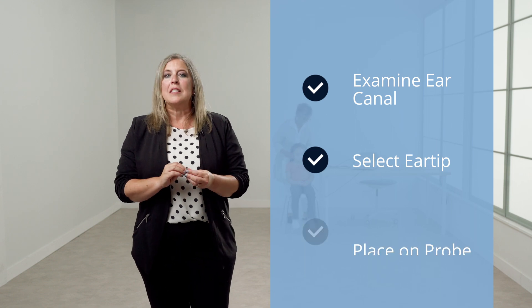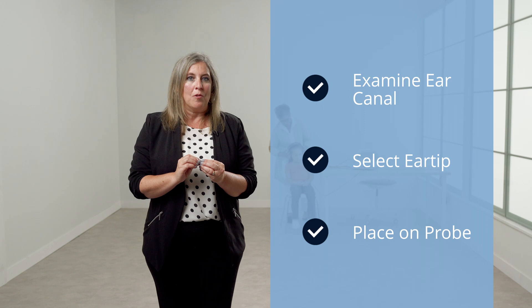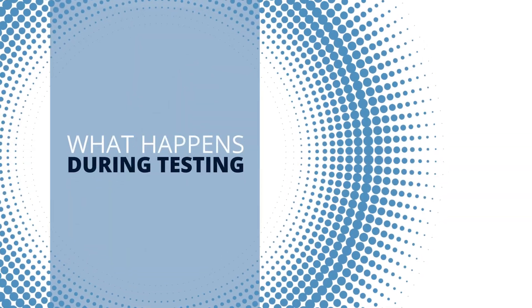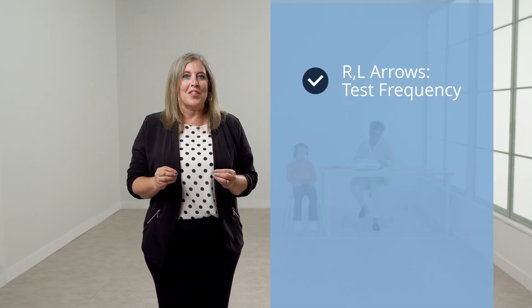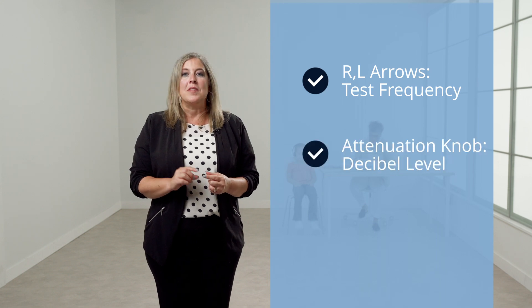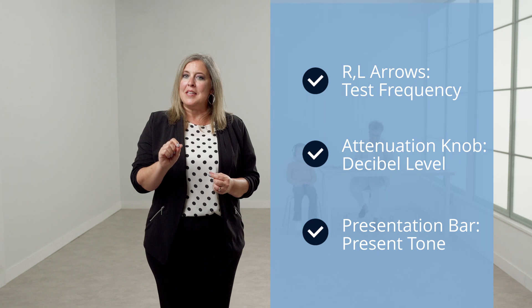For insert phones, examine the ear canal for obstruction or excessive cerumen. Place the tube of the foam ear tip completely onto the sound tube for each earphone. Roll the foam tip to the smallest diameter possible and insert the ear tip well into the ear canal, with the red earphone in the right ear and the blue in the left ear. Select the test frequency using the right and left arrow buttons. Select the decibel level with the attenuation knob. Present the tone by pressing the presentation bar. Follow the screening guidelines of your facility. You will record the results by pressing the M plus button when each frequency is complete.